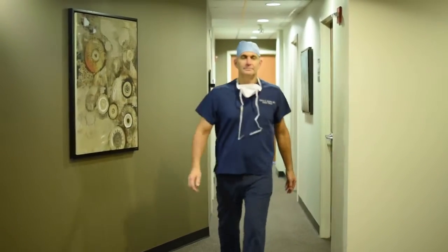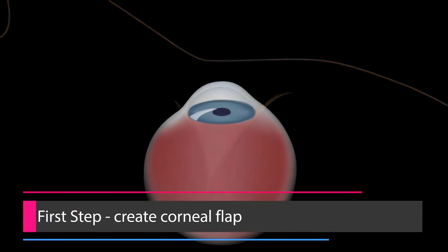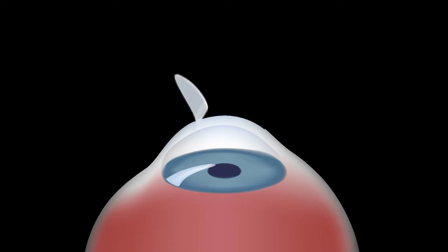This is not the same LASIK procedure that I started doing 20 years ago. This is called all laser LASIK. LASIK itself is a two-step process. In the first step of LASIK, we actually create what's called a corneal flap, where we make a gentle cut in the cornea and lift it back.